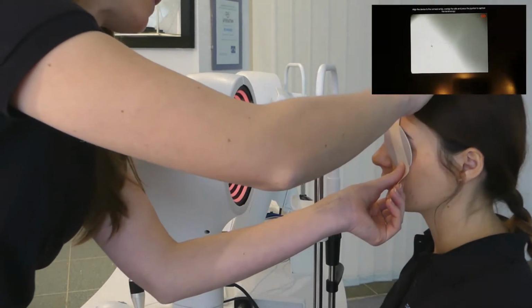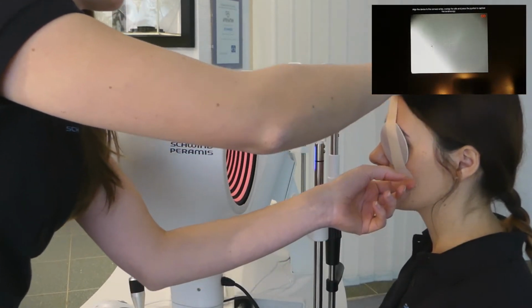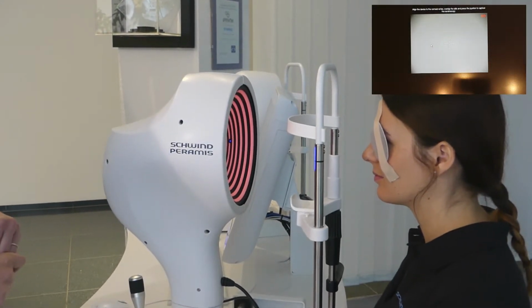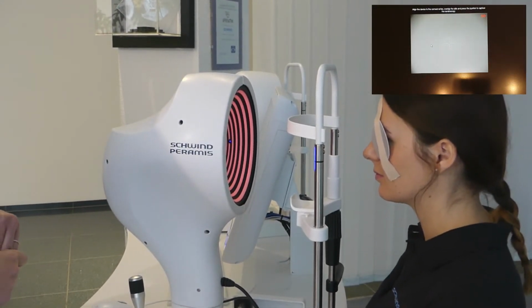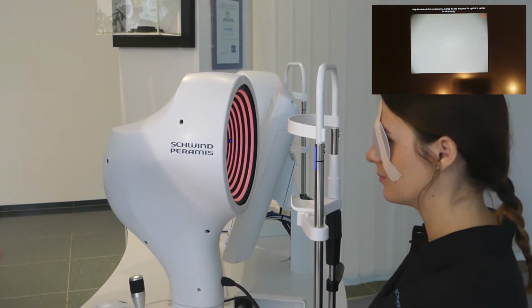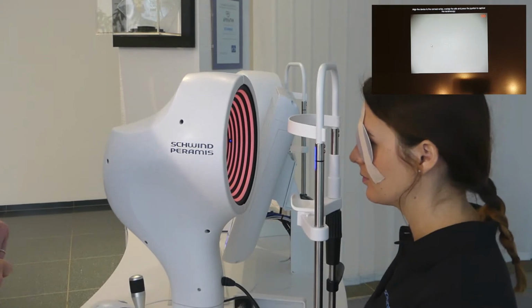Therefore, I'm using an eye patch. This will help the patient easily to fixate the target inside the device. In the Schwind PERAMIS, the patient will see a red fixation target.